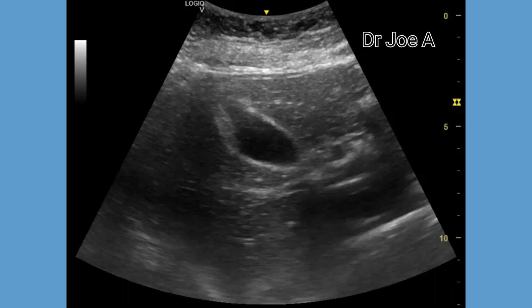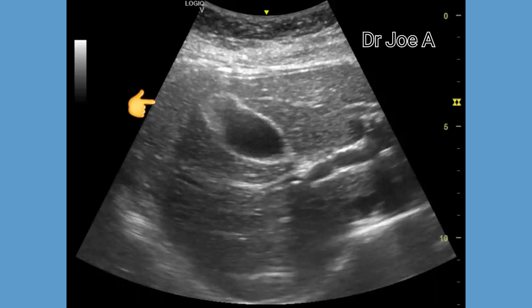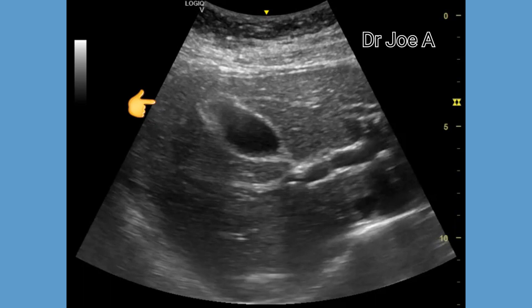Gallbladder adenomyomatosis is associated with cholecystitis and gallbladder calculi. Though usually asymptomatic, many patients have right hypochondrial pain.